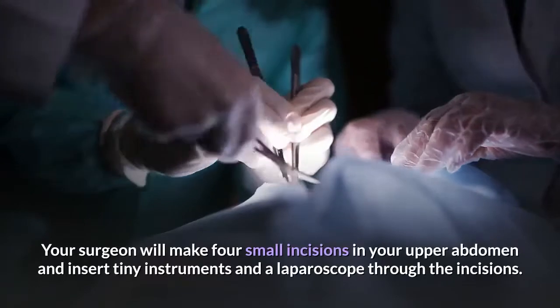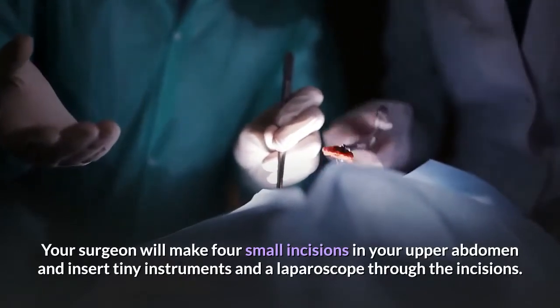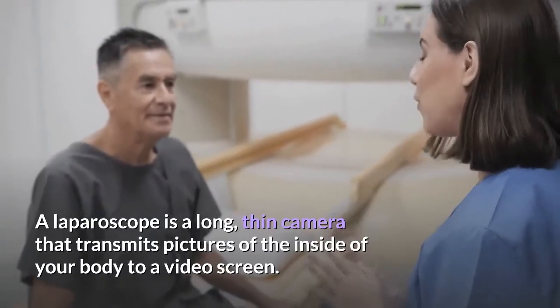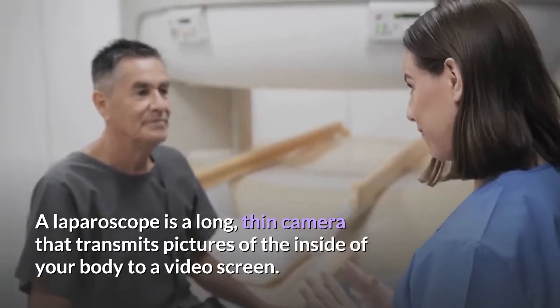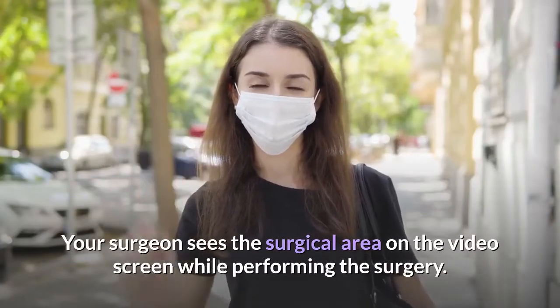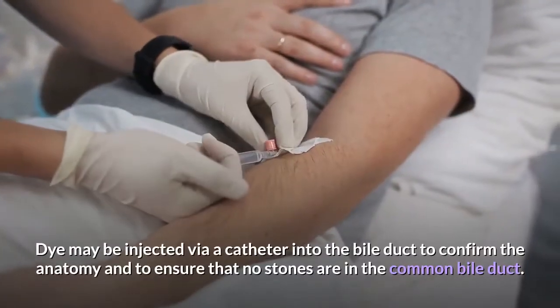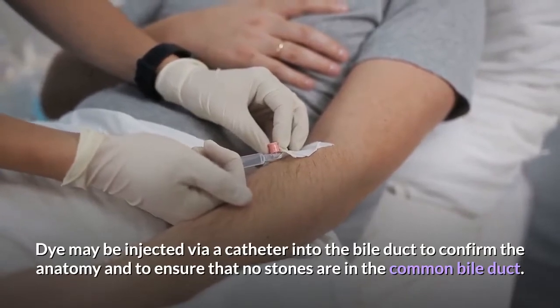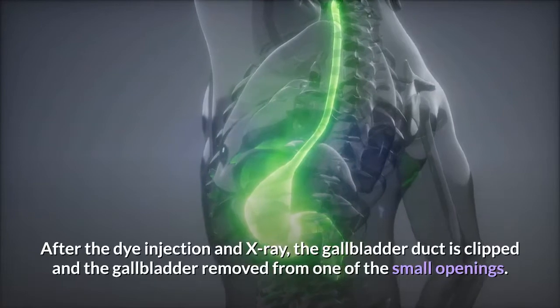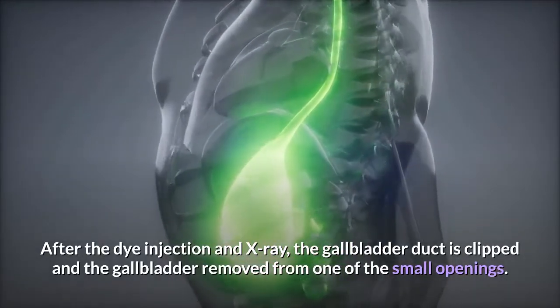Your surgeon will make 4 small incisions in your upper abdomen and insert tiny instruments and a laparoscope through the incisions. A laparoscope is a long, thin camera that transmits pictures of the inside of your body to a video screen. Your surgeon sees the surgical area on the video screen while performing the surgery. Dye may be injected via a catheter into the bile duct to confirm the anatomy and to ensure that no stones are in the common bile duct. After the dye injection and X-ray, the gallbladder duct is clipped and the gallbladder removed from one of the small openings.